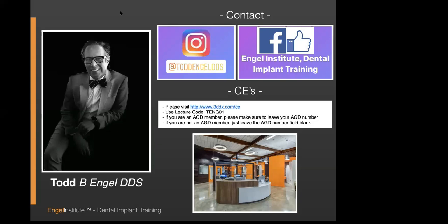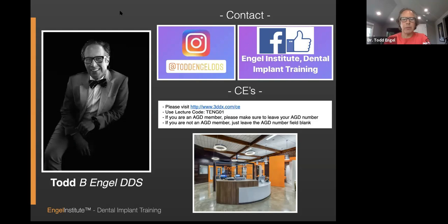Thank you, Dr. Engel. Another question is, Dr. Paris Donastrog, he wanted you to explain again what you did with the apical case and the tetracycline. Okay, that's always the one that gets everybody. I'm having a problem going back, so let me tell you.